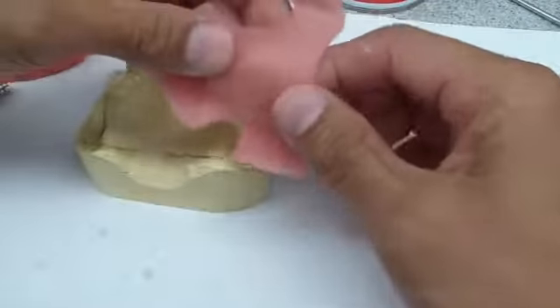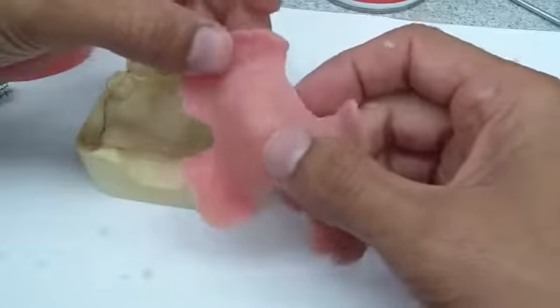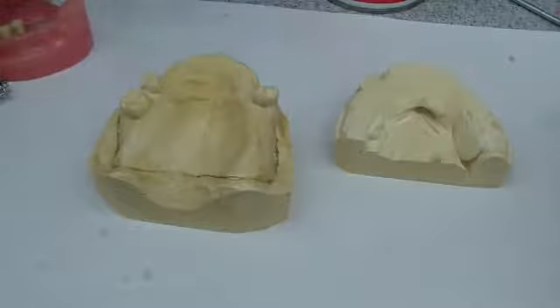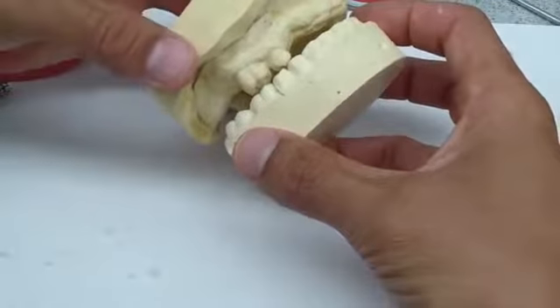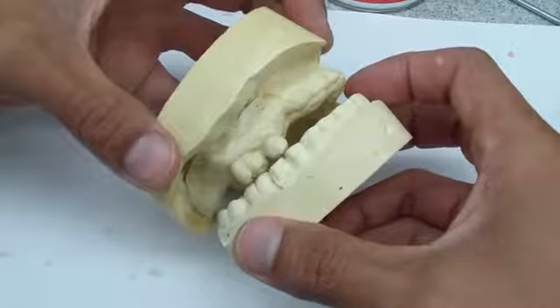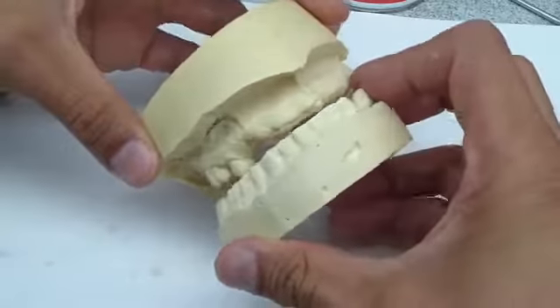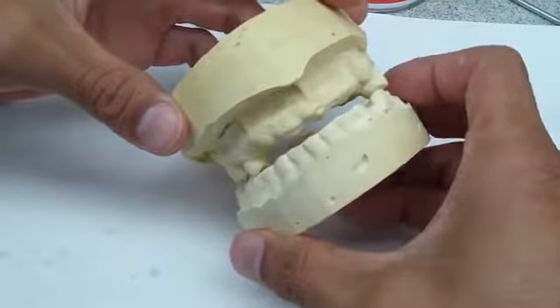Now the reason why we're using this is because this is a fairly stable platform. I mean, you can use Blue Mousse, you can use whatever product you are happy with, of course, and there are many different ways of doing it. And this is just one way of using a denture base with a bit of wax and some Blue Mousse in an effort to be able to mount these in the correct 3D position in centric relation.